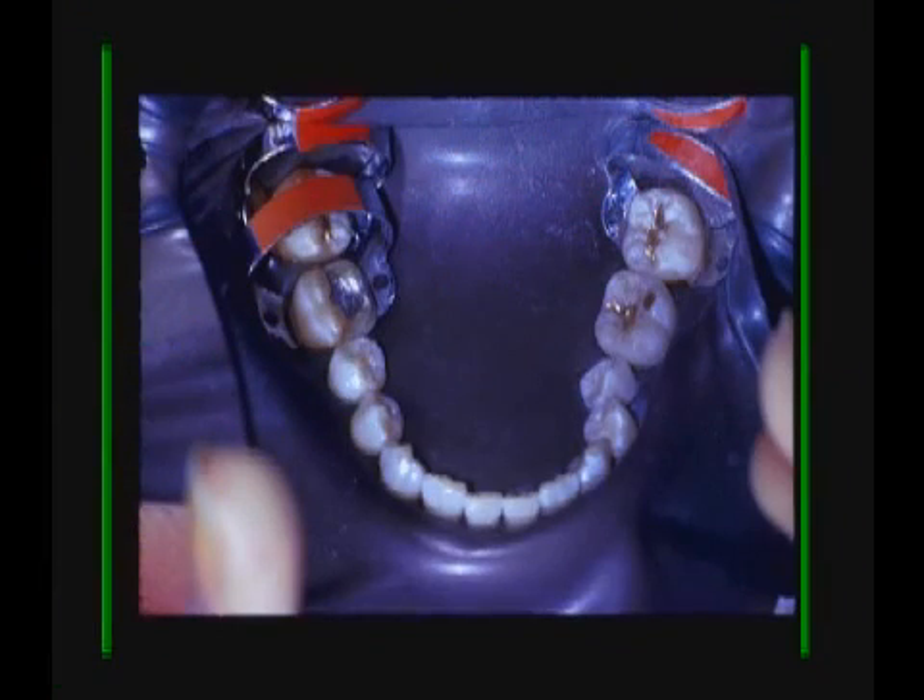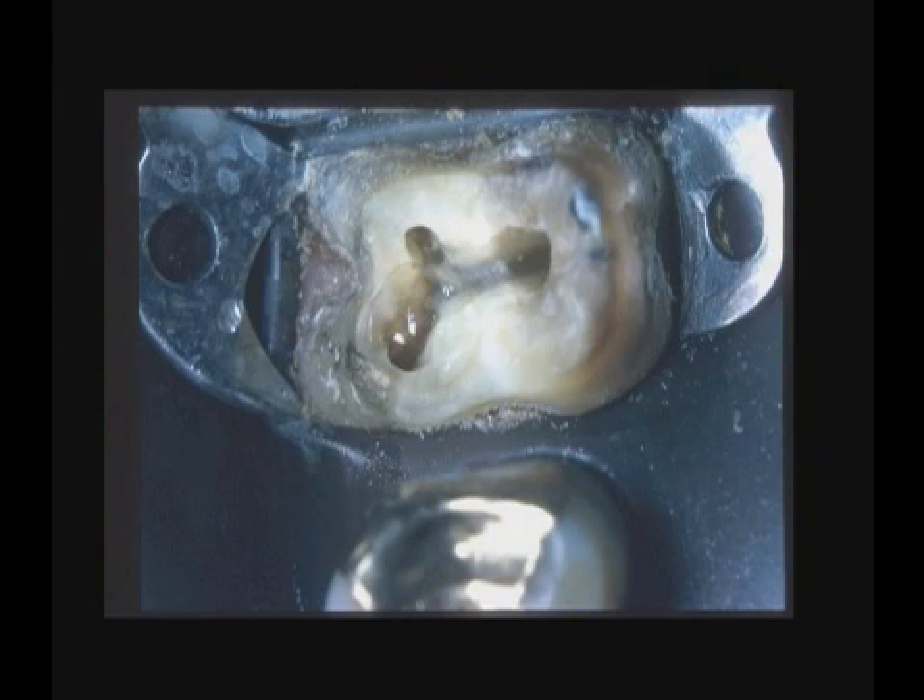You have to have at least three or four of the B1s available on your tray so that you can use them as rubber dam retainers and as tissue retractors. If you notice on this upper molar tooth, the palatal root is a little smaller.